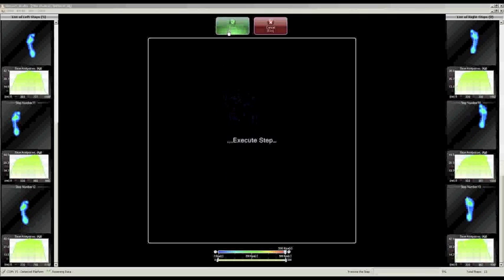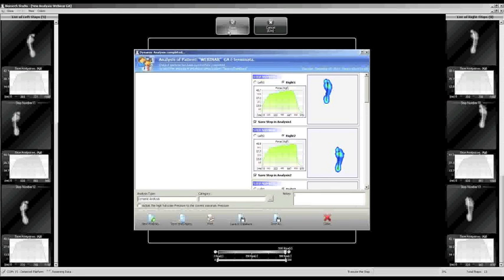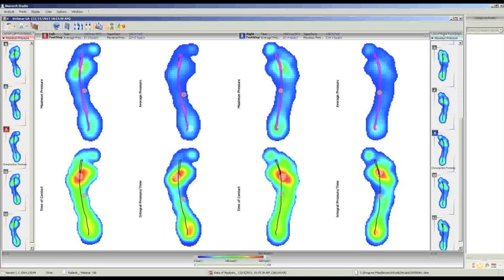Automatically, the software shows a new window where you can see all the detected footprints. You control that it detects the correct position, and when we are sure it has detected the correct position of the foot on the platform, we just have to save and display the analysis directly.